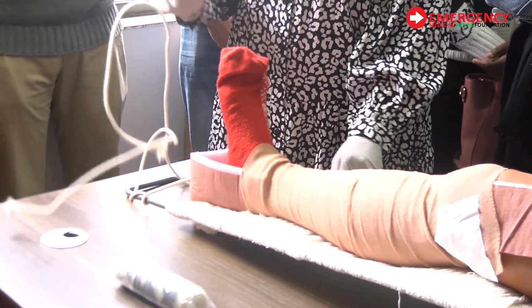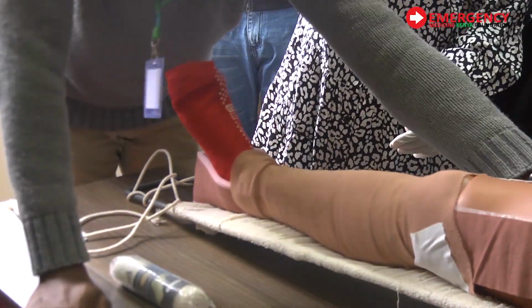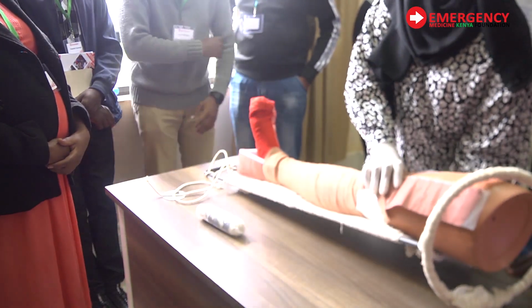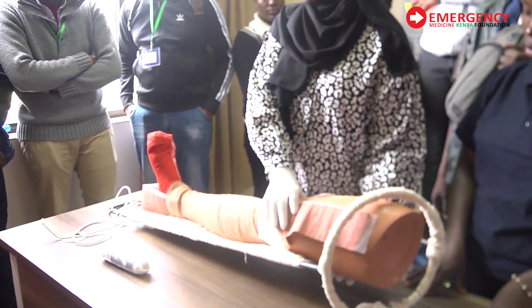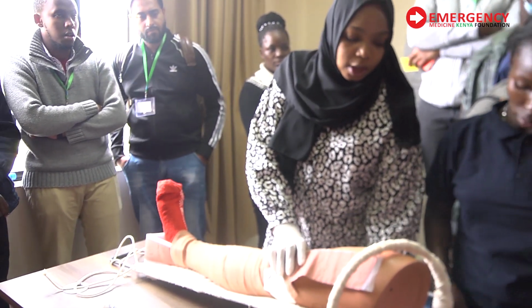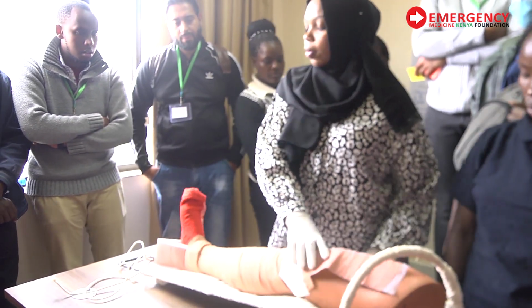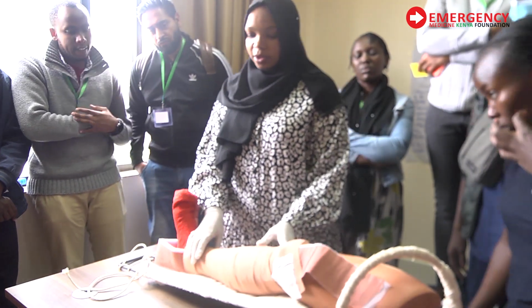Okay, you want to try? Yeah. You can try to put something to stabilize anything, because sometimes your Thomas splint cannot be reaching up there. So anything to make the patient a bit comfortable. Okay, anything. You can use sheets, you can use pillows, anything to make it comfortable. Okay. All right.